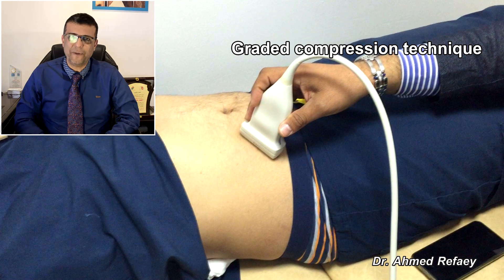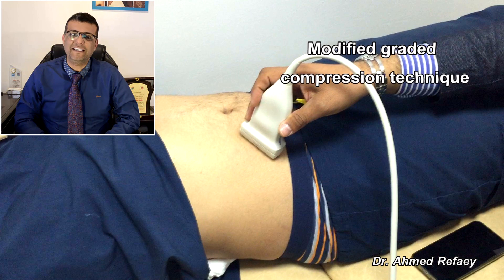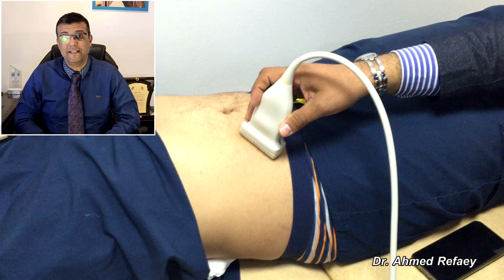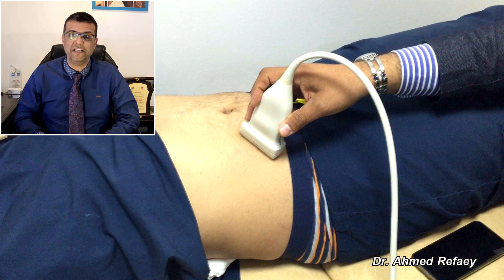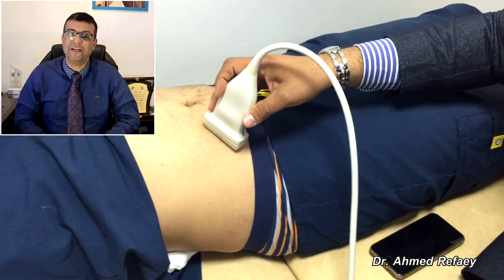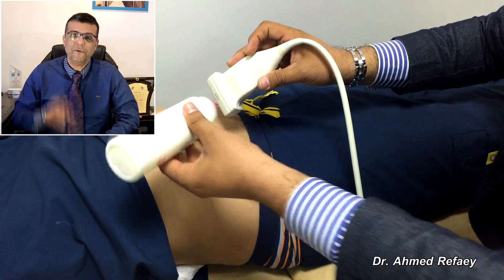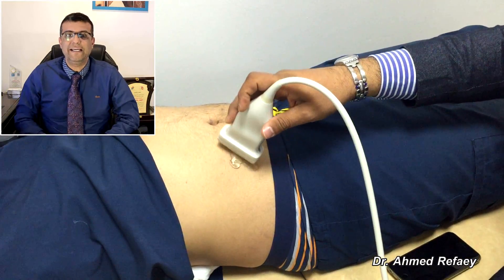After that, use the graded compression technique or modified graded compression technique. This is a technique used to demonstrate the features of acute appendicitis, as the appendix is usually covered by multiple gas-containing bowel loops. Gas is a big enemy to ultrasound, as it masks and conceals any structure behind it. So put your probe at the site of pain in the right lower abdomen.